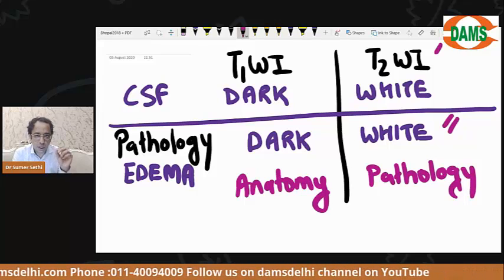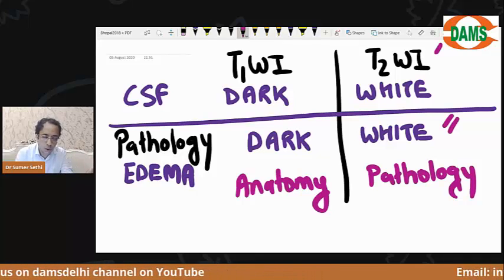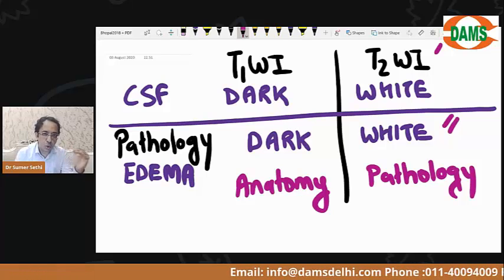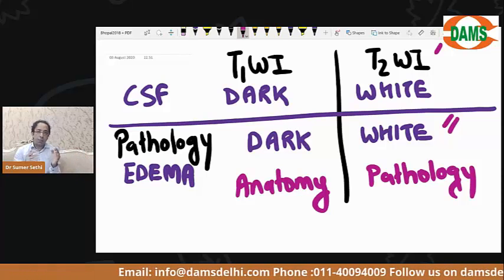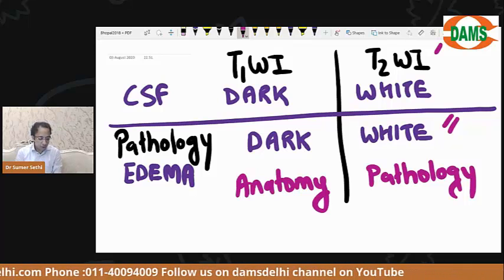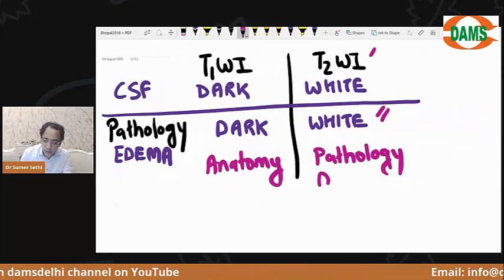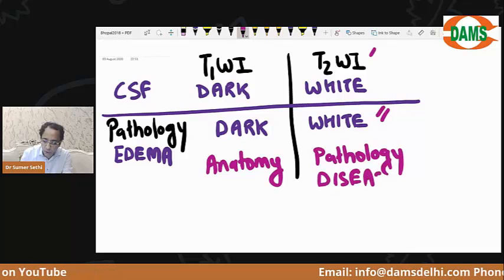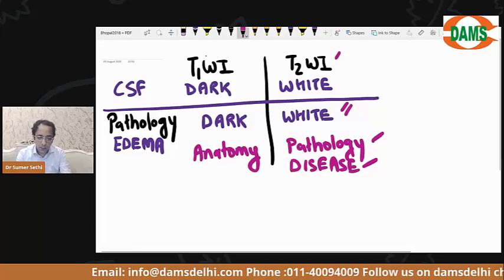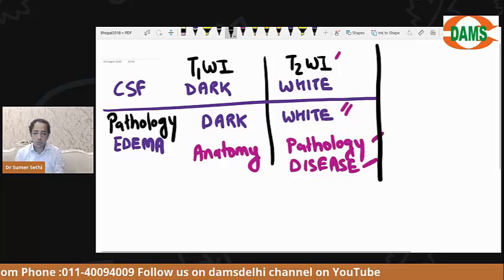In every patient, we will look at both the images, T1 also, T2 also, to understand what we are looking at. One image in itself has no meaning. We have to look at both T1 weighted and T2 weighted in MRI. Are you clear now? Which MRI sequence is disease specific, able to see the disease tissue? T2 weighted image. Now understand and tell me, look at the table and answer, and then we are going to shift to visuals after this.